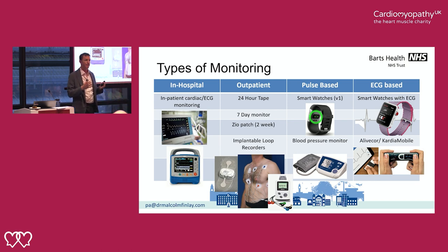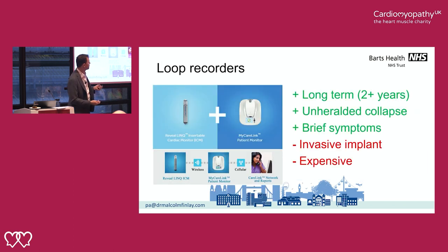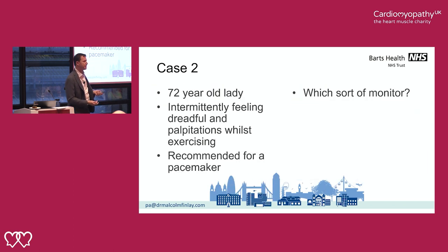So when they felt unwell, they could take their own heart monitor, not just the heart rate but actually record an ECG and ping it up to me. That happened, lo and behold. Two to three months later, I got an ECG showing atrial fibrillation. We treated that, and things have been fine. So we don't necessarily have to go to that heavy, deep medical route to get the answer. And let's face it, it's the answer for the people we're trying to help.